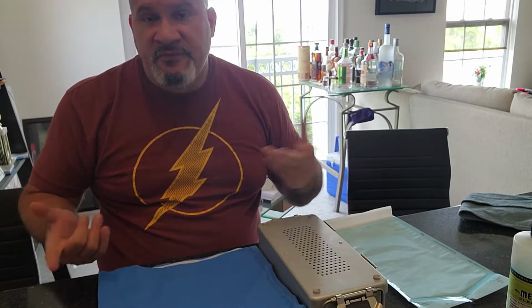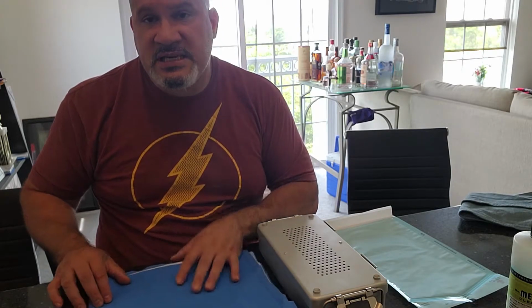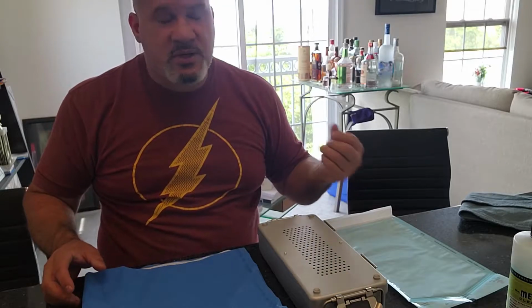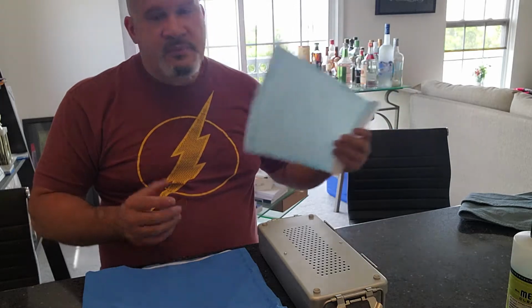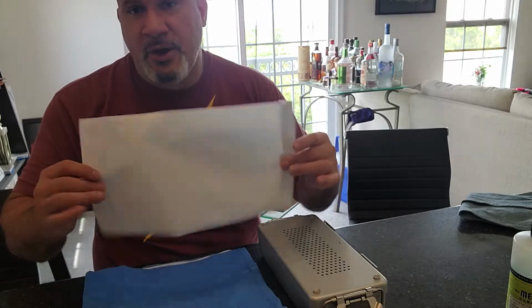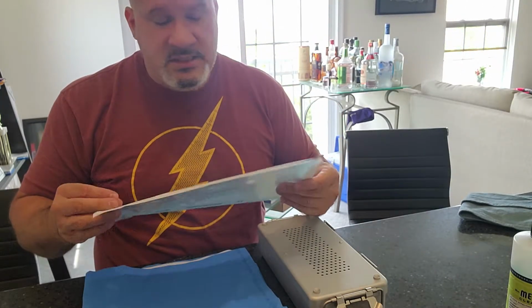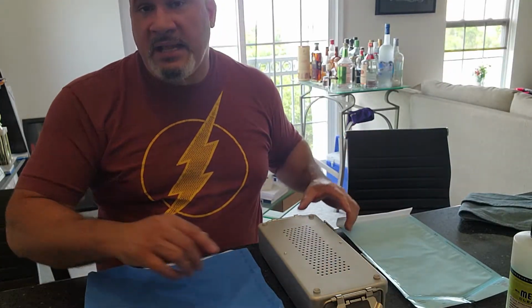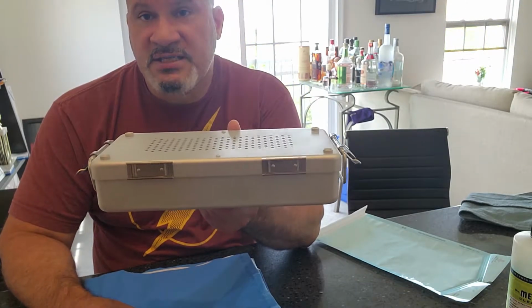Well, no. The first thing you do to pick a packaging system for whatever modality of sterilization you choose is make sure that the item is validated to be used in that modality. In layman's terms, I know, and that's been taught, that paper plastic pouches can't go into the hydrogen peroxide system. I know that can't happen. What I didn't know in my career is that you can't put just any container system in hydrogen peroxide either.